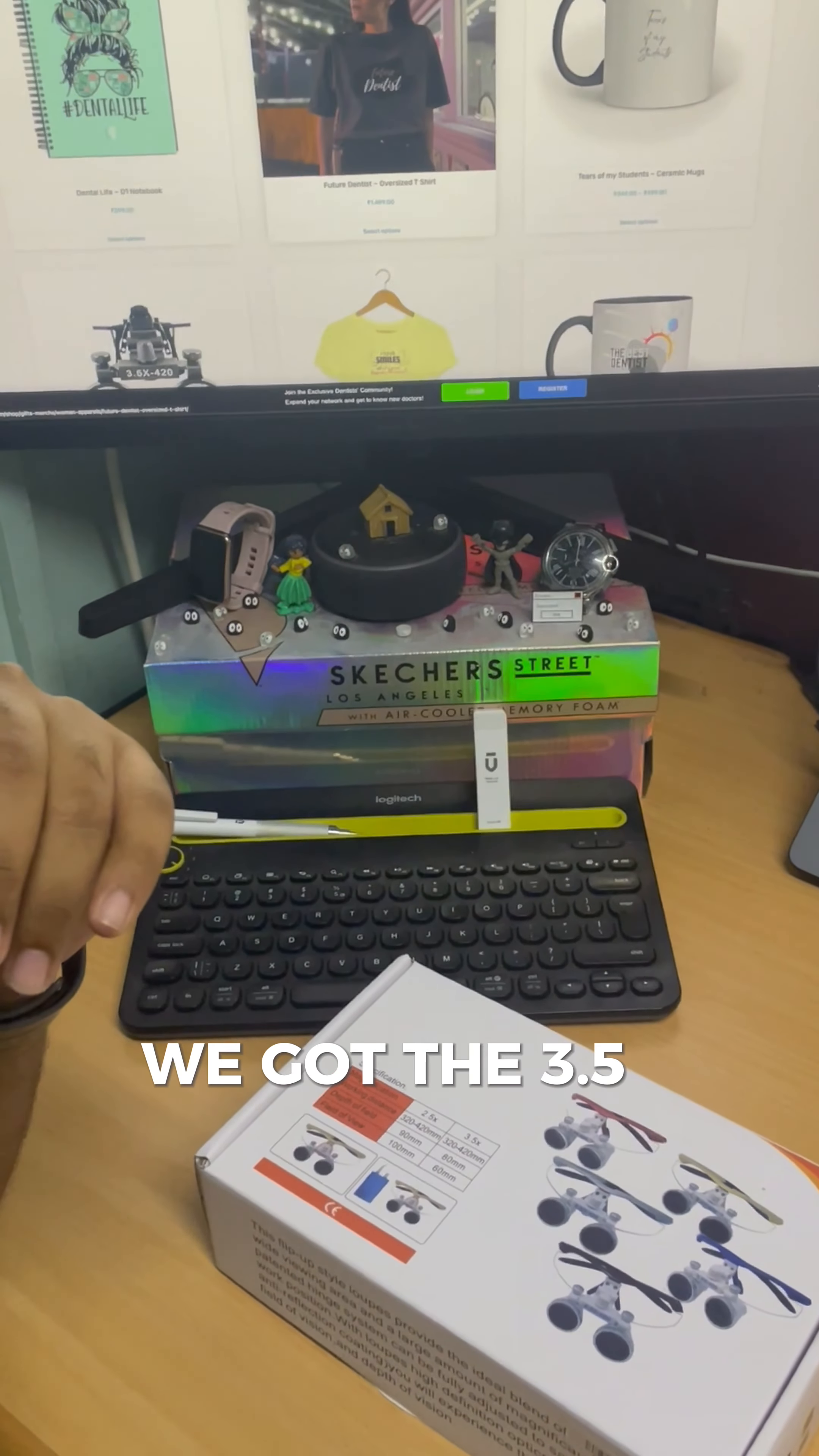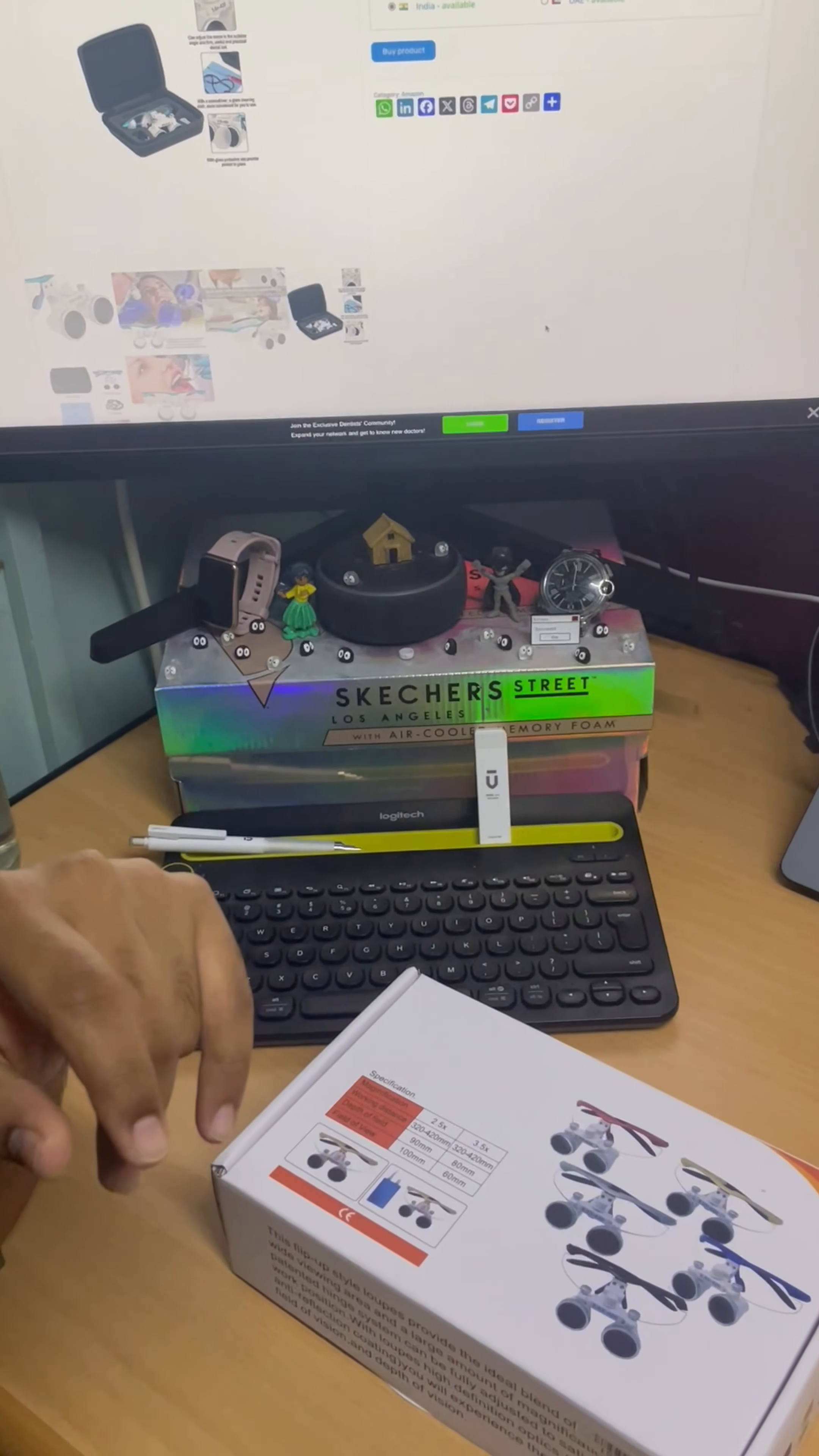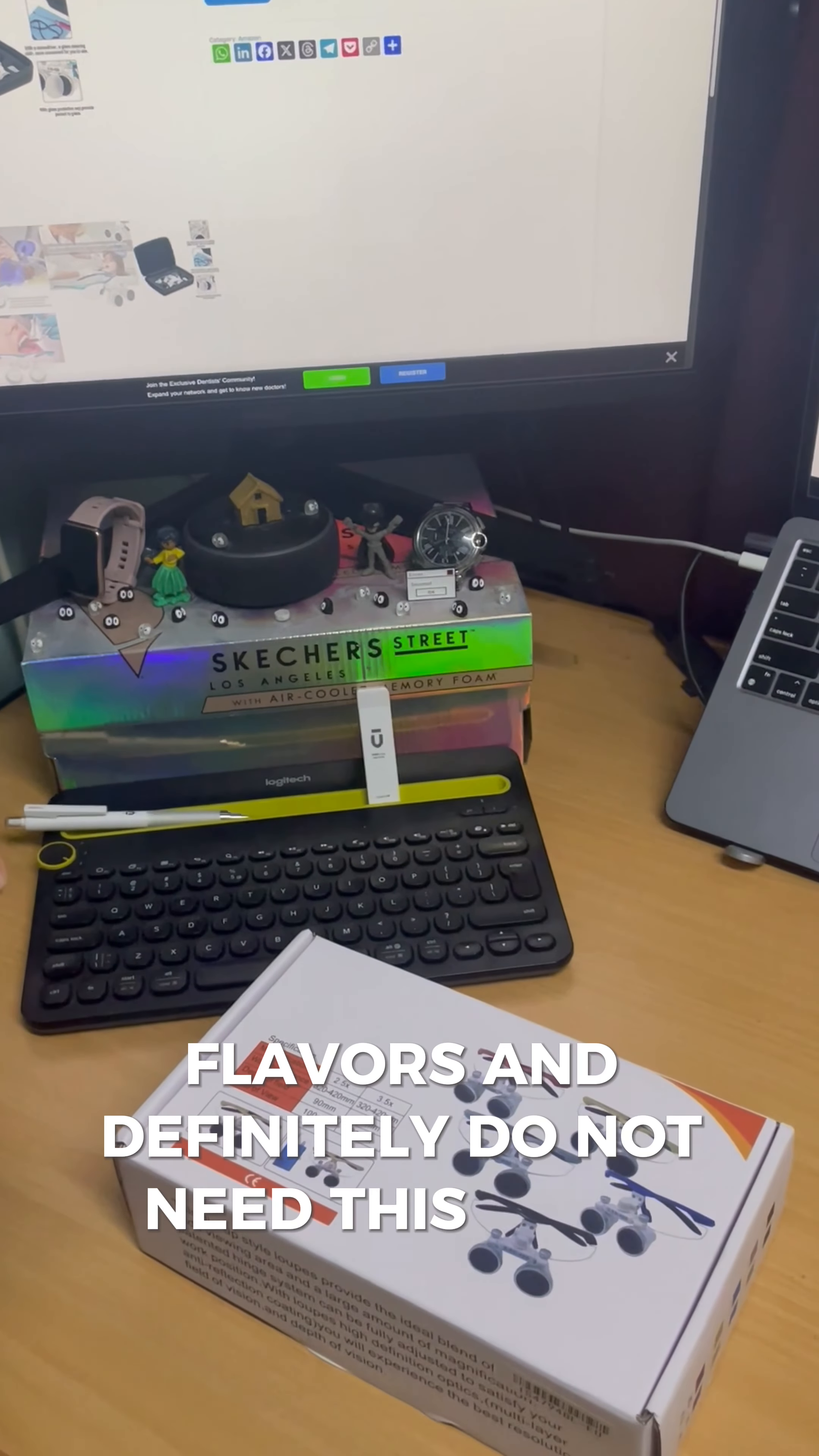We got the 3.5x magnification loupes as it is an excellent starting point for new users. The experts obviously have their own taste, flavors, and definitely do not need this video.